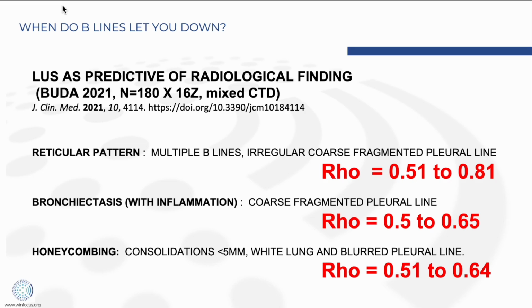And it's important then to recognize that irregularities of the pleural line do not correspond to alteration of the anatomical pleura that is involved in the disease. Rather, this sonographic image of an irregular pleural line is the effect of the subpleural interstitial alterations, with decreases of aeration in the lung periphery. So although we may observe a perfectly regular pleural line with multiple B-lines in the early phase of the disease, the irregularity of the pleural line is always, by definition, accompanied by B-lines.